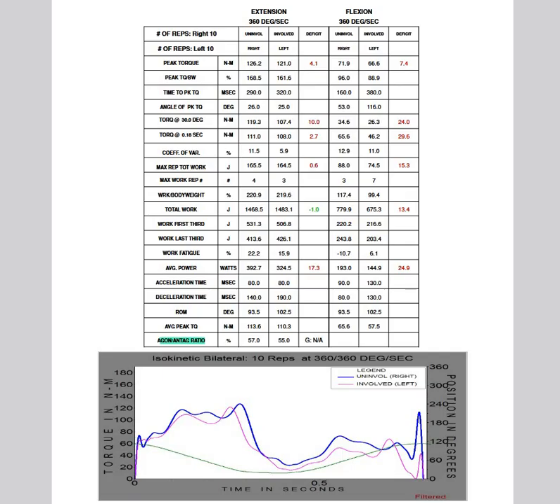So there is sometimes some confusion with how this is presented because you have two values reported down here for our HQ ratio. So we have 57 and 55 here, and no values under the flexion set of columns for the right and left leg, and that's fairly straightforward to explain. Let's focus just on the right leg for a moment.